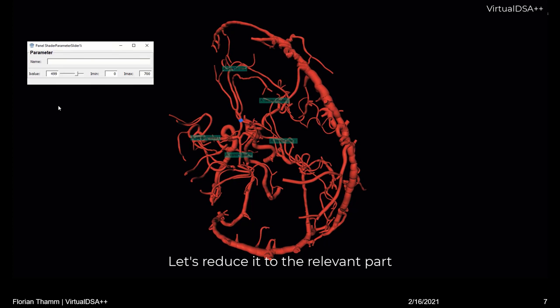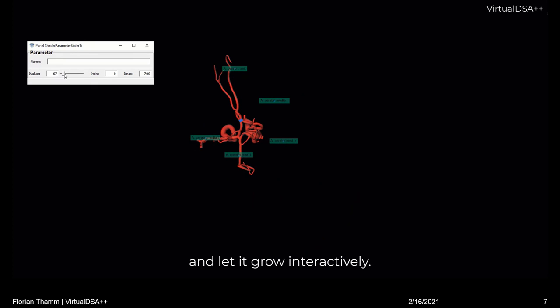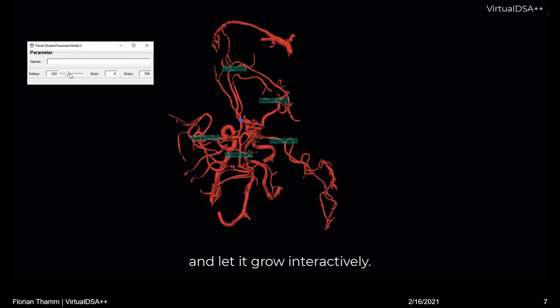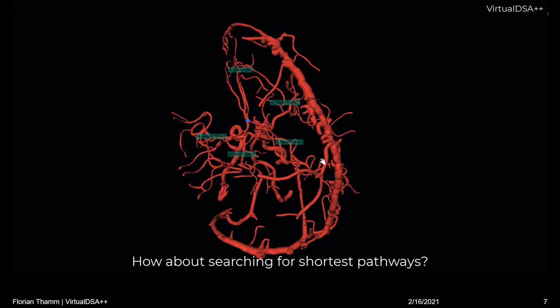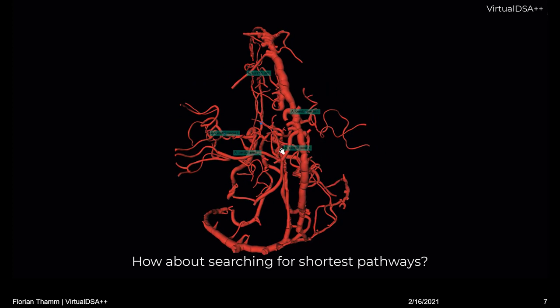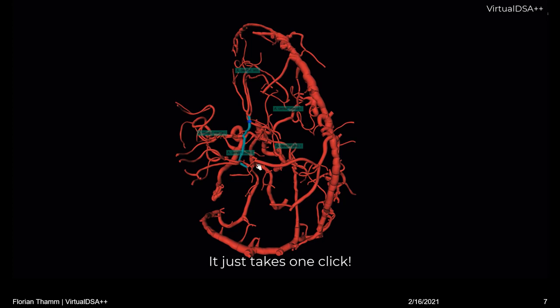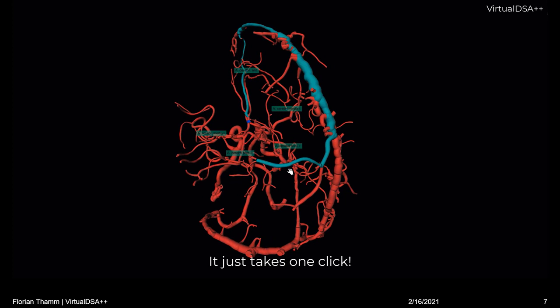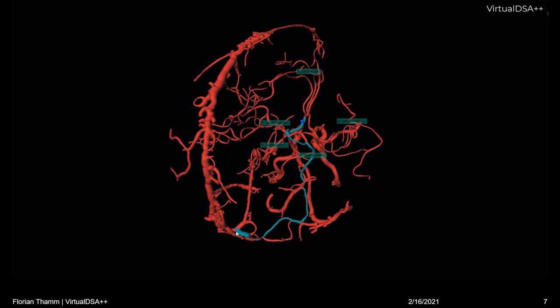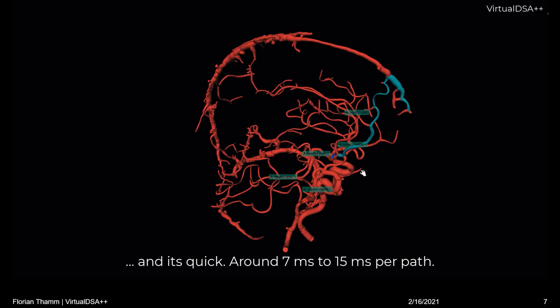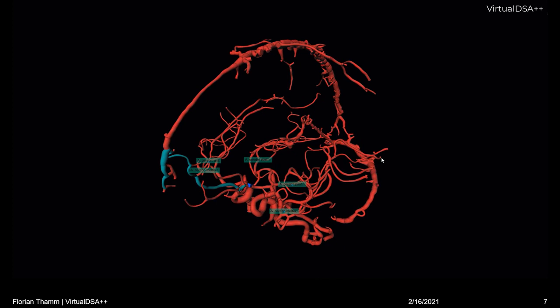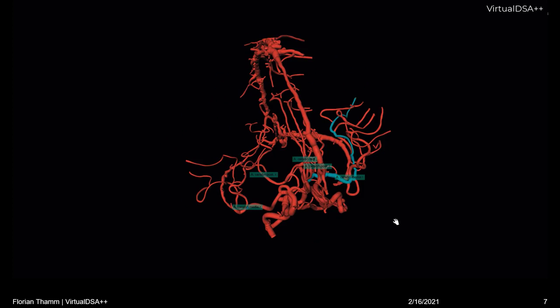We can now use the graph search to reduce the model to the relevant parts. For this purpose, we change the running distance and set the desired one — we can let it grow interactively. That is vein suppression. We can also now search for shortest pathways, just by clicking the desired goal point. It's quick as well — it just takes 7 to 15 milliseconds per path, as it is already cached in the background. We have done the whole graph search and just reuse our results.